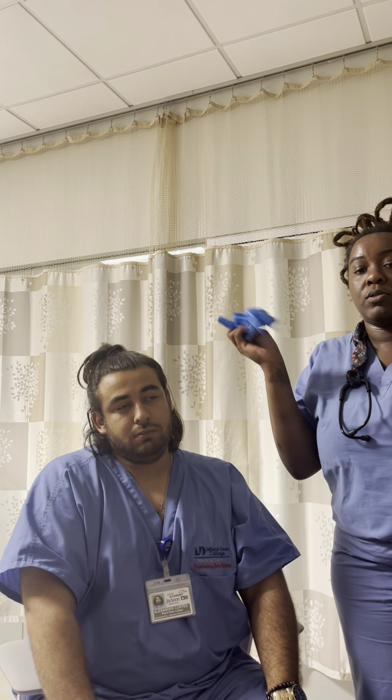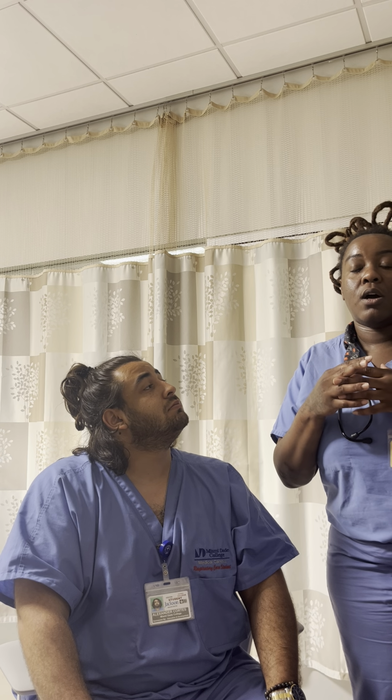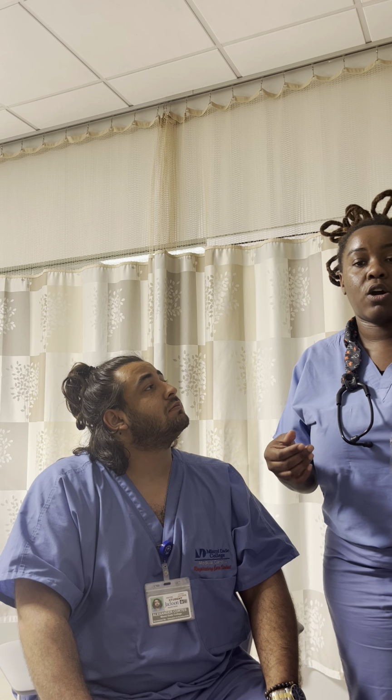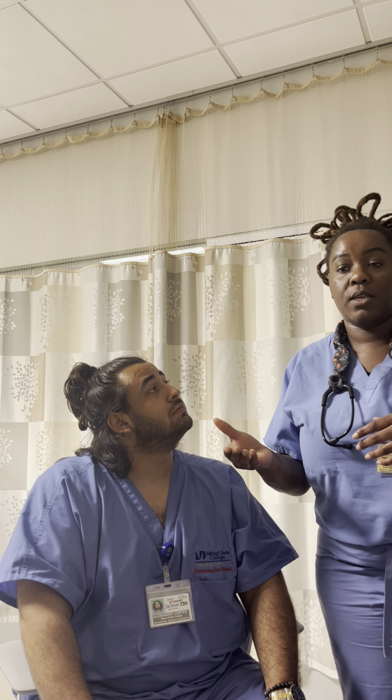PPE, decontaminate my hands, wash them, or put sanitizer on them for 15 seconds. Then I'm going to chart and relay the information to my health team. Okay, thank you so much.